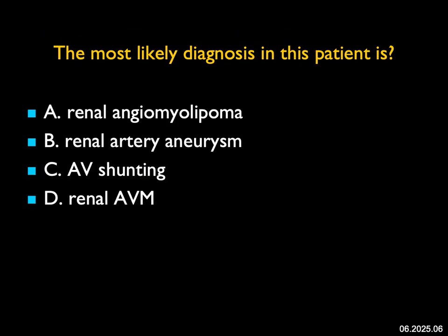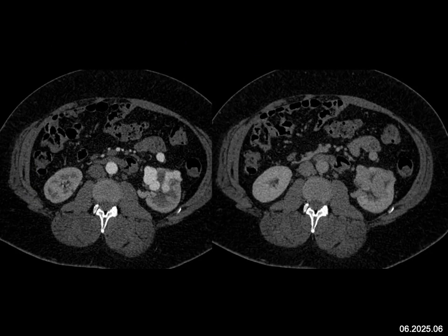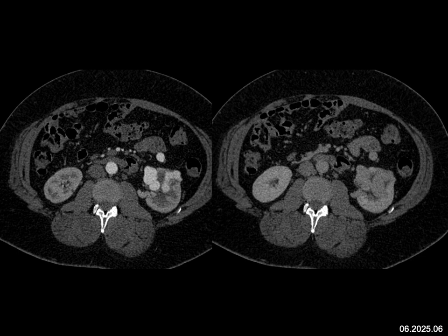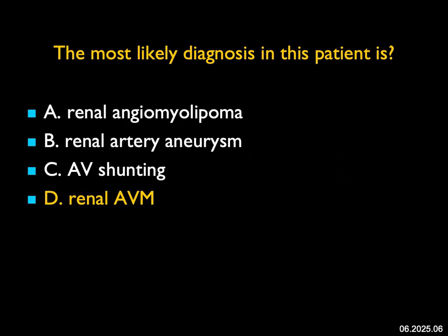The most likely diagnosis in this patient — arterial and venous phase imaging. There's a very bright tubular structure in the right kidney on the arterial phase. On the venous phase, everything washes out to low density, meaning this is a vascular structure — a tumor would not de-enhance so quickly. I don't see fat, so it's not a myelolipoma. It's not an aneurysm. I see tubular structures consistent with AV shunting, and the best diagnosis is a renal AV malformation. AVMs are very bright on arterial phase and quickly wash out. On venous or delayed phase imaging they can easily be confused with a tumor. A really nice example of a renal AVM.